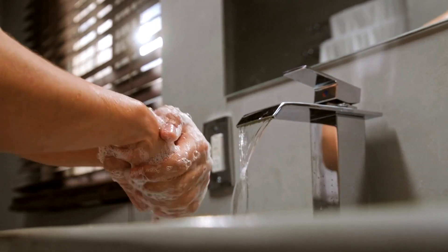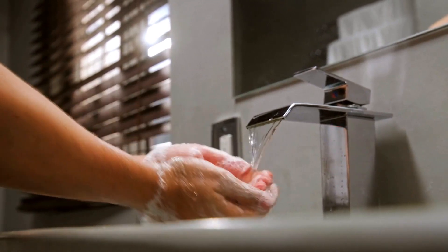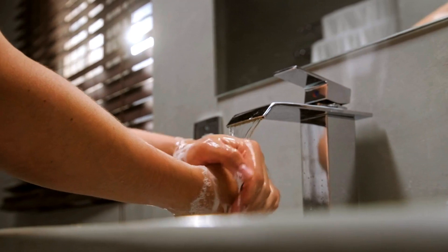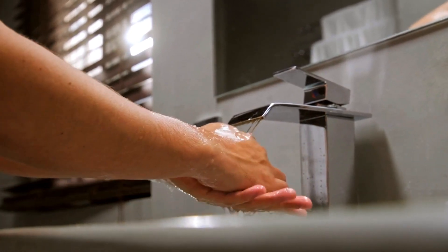Thorough hand washing should take at least 20 seconds. Wet your hands with water and apply enough soap to cover your hands. Rub your hands together, taking care to rub palm between fingers, thumbs and wrists. Be sure to repeat this process with your other hand.